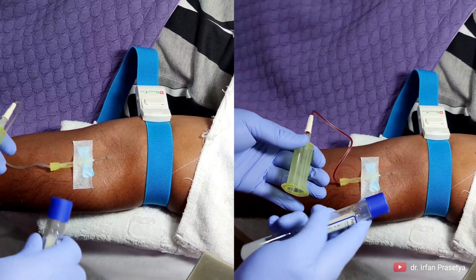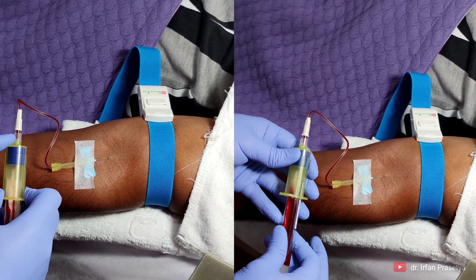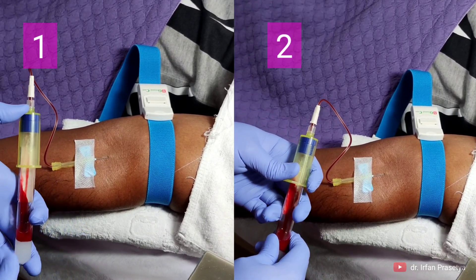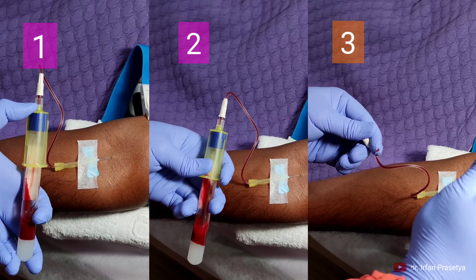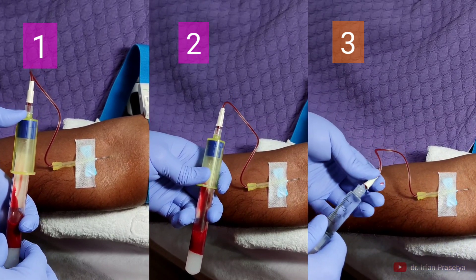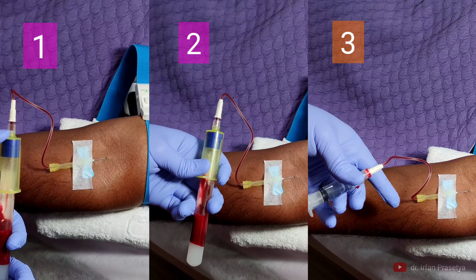Yang kedua adalah dari sisi kenyamanan. Kalian bisa lihat contoh yang tadi saya praktekkan — itu adalah contoh yang bagus. Di sini saya ada tiga tindakan, di mana saya ambil darah dua tabung plus satu kali injeksi antioksidan dalam satu waktu. Bayangkan kalau itu harus menggunakan spuit — mungkin bisa saja harus tiga coplokan, ini benar-benar menyiksa pasien. Kalau kita menggunakan vacutainer, kita bisa manuver, bisa melakukan pengambilan darah semau kita.